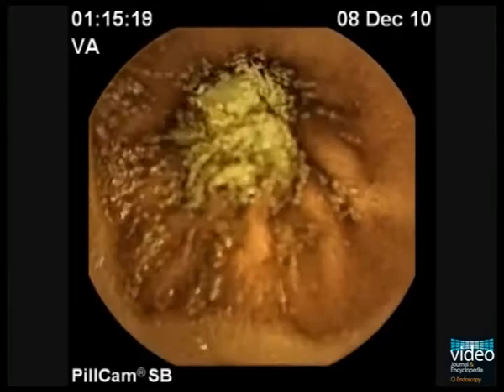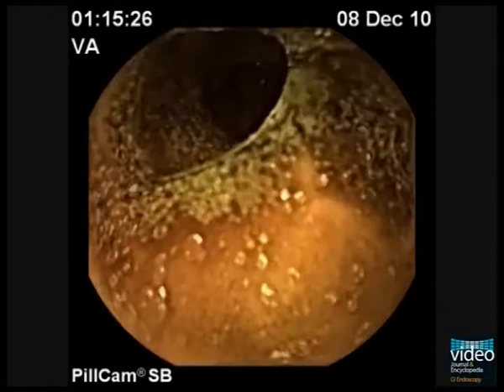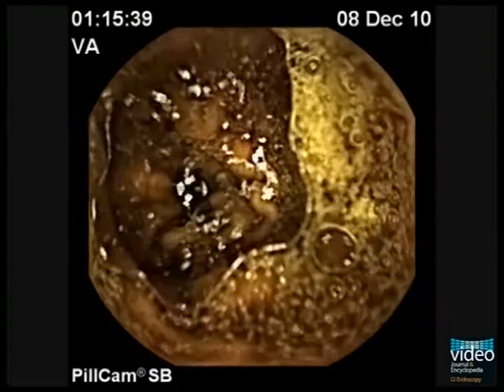The frames shown here are at 1 hour and 15 minutes from capsule ingestion, exactly half of the small bowel recording time. In these frames, luminal content is scarce and increasingly dark. There are some bubbles limiting the endoscopic view to some extent.